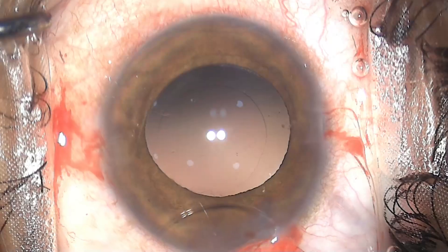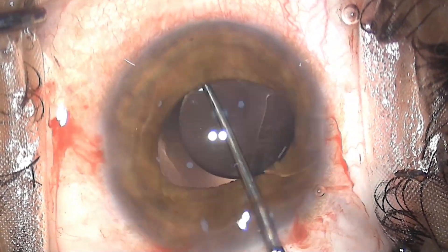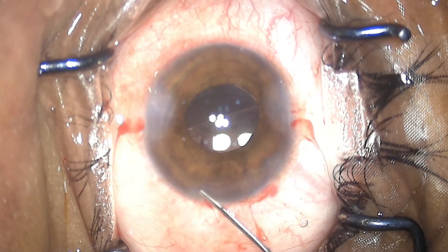Make sure that there is no flap, and you can easily put a lens. But that could have been avoided. The case will be six-six, but that's not the point — the point is how to get better.